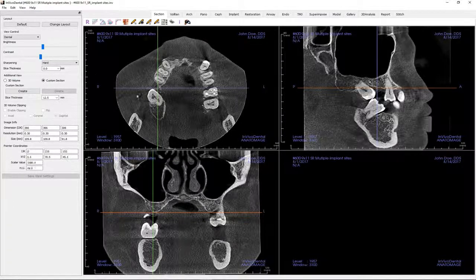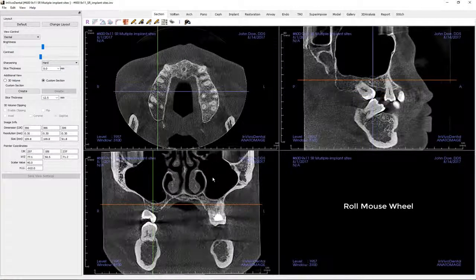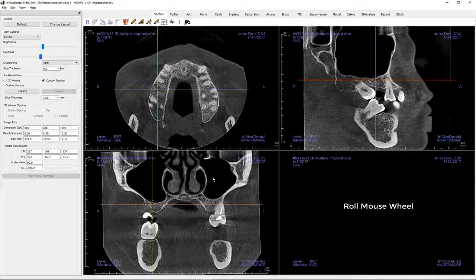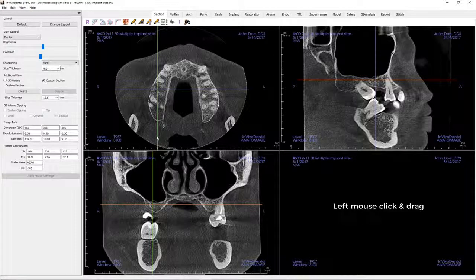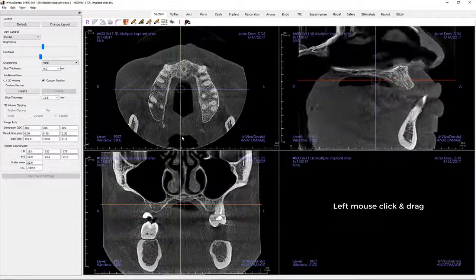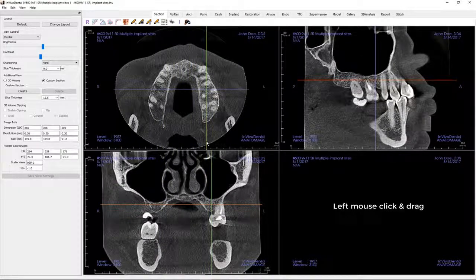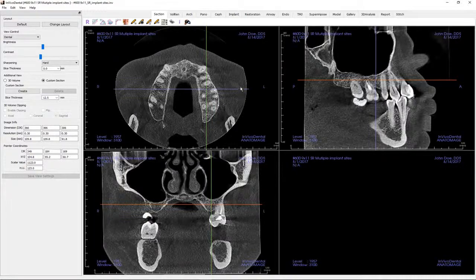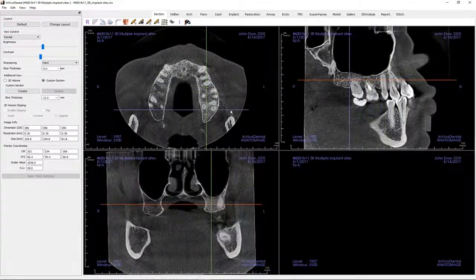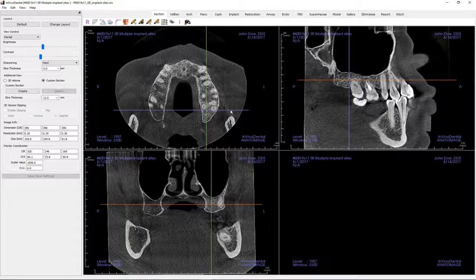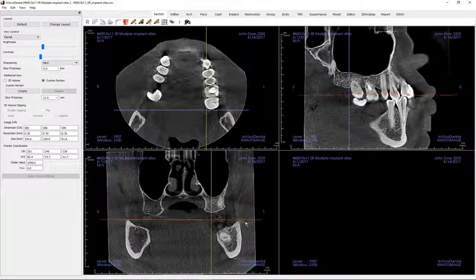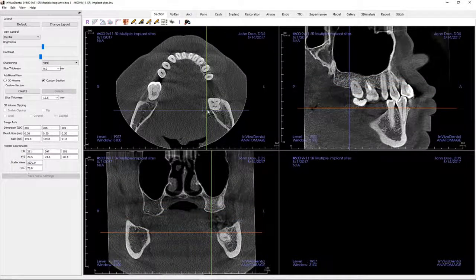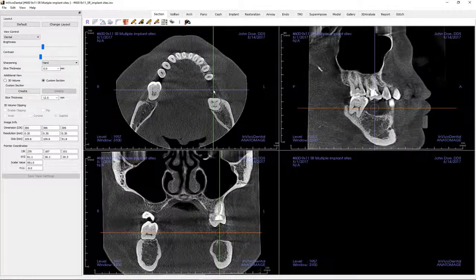Now let's navigate through these slice sections. There are three ways to do this. First, move the mouse cursor to the desired plane and use the scroll wheel to move one section at a time through the data slices. Second, grab one of the cursor lines by left mouse clicking on it and, while holding down the left button, move the mouse to the desired location. Green lines move through the sagittal slices left to right, blue lines move through coronal slices anterior to posterior, and red lines move through axial slices inferiorly to superiorly. Third, place the mouse pointer at the intersection of the cursor lines and, while depressing the left mouse button, move your mouse to an anatomical location of interest.